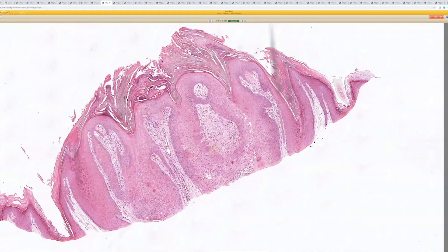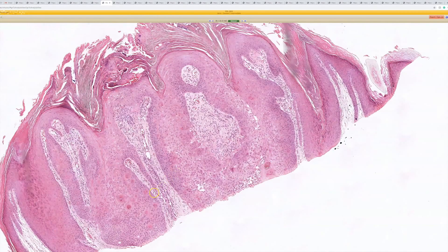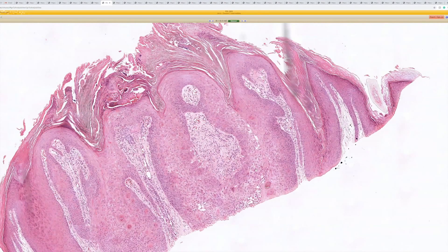So I think those are all three benign things that can look like one another. And the main thing is that you don't confuse them with a carcinoma. So a nice example of inverted follicular keratosis.